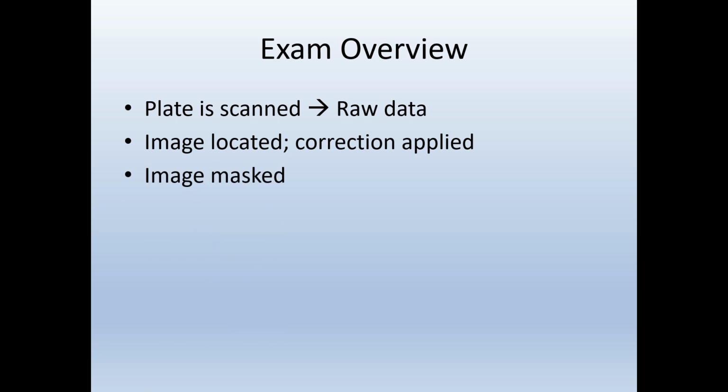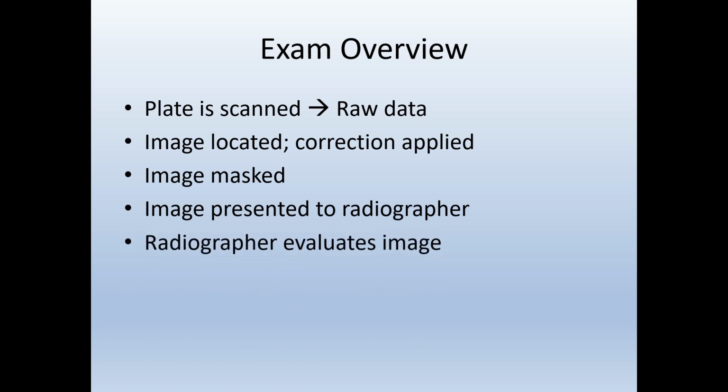Finally, the image is masked to eliminate white borders around the periphery of the image and to alleviate eye strain for the radiologist. The image is displayed so the radiographer can evaluate it for diagnostic quality. If the radiographer applies any changes to the image in post-processing, it is important from a medical legal standpoint that these changes be documented as part of the patient's record. Once the evaluation is complete, the patient is released, and the exam is posted to the PAC system for storage and subsequent reading by the radiologist.